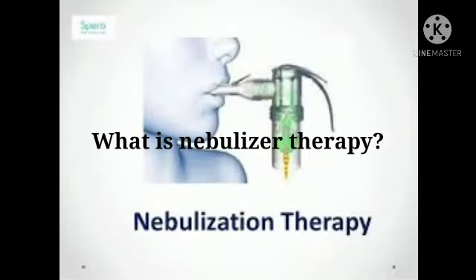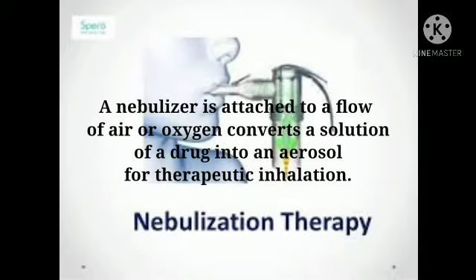What is nebulizer therapy? A nebulizer is attached to a flow of air or oxygen, and converts a solution of a drug into an aerosol for therapeutic inhalation.